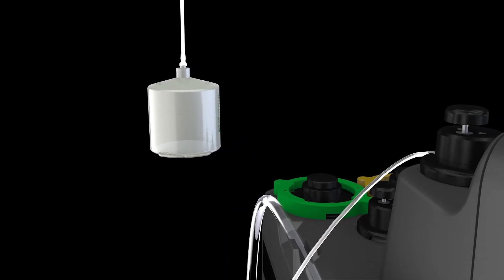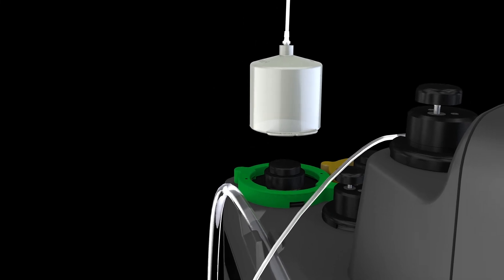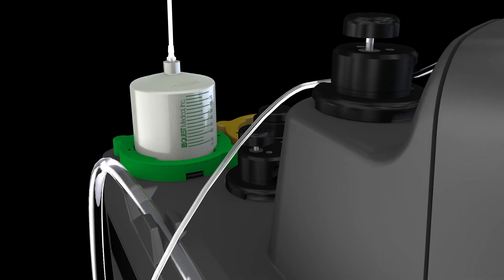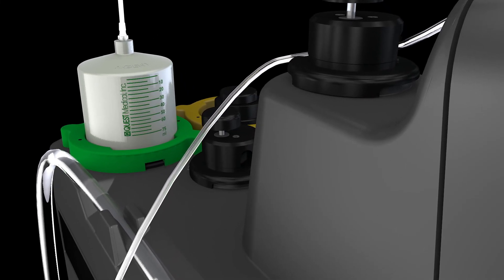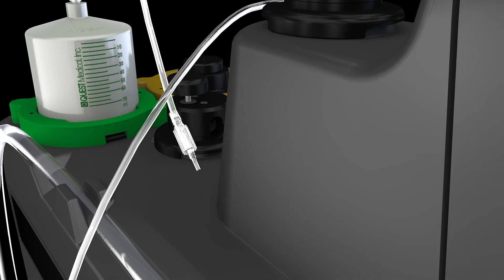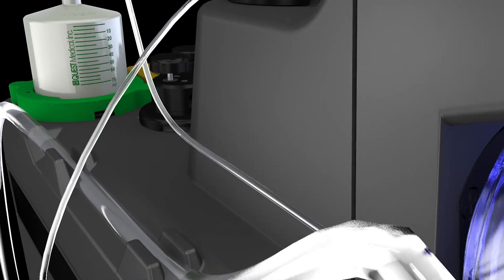Align additive cartridge into green additive key and turn clockwise until the cartridge clicks into place. Green milliliter markers should be front facing. Pick up other end of additive delivery line and attach to the check valve fitting at the lower left port of the heat exchanger.